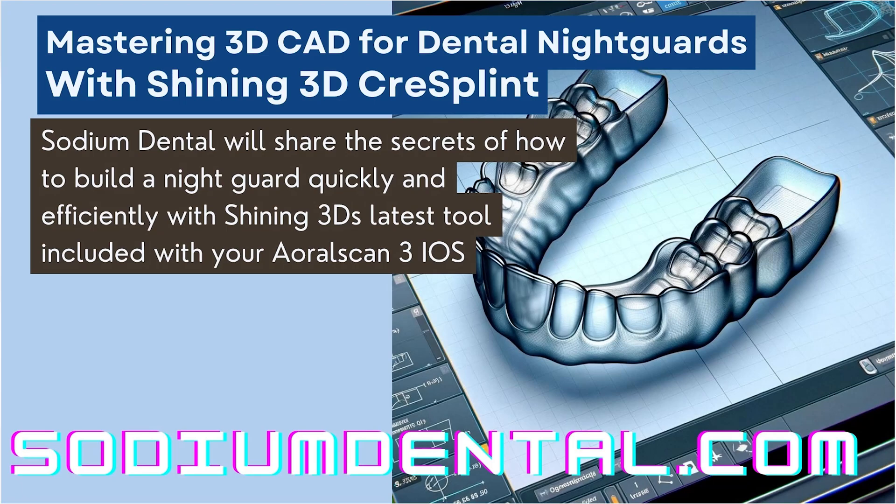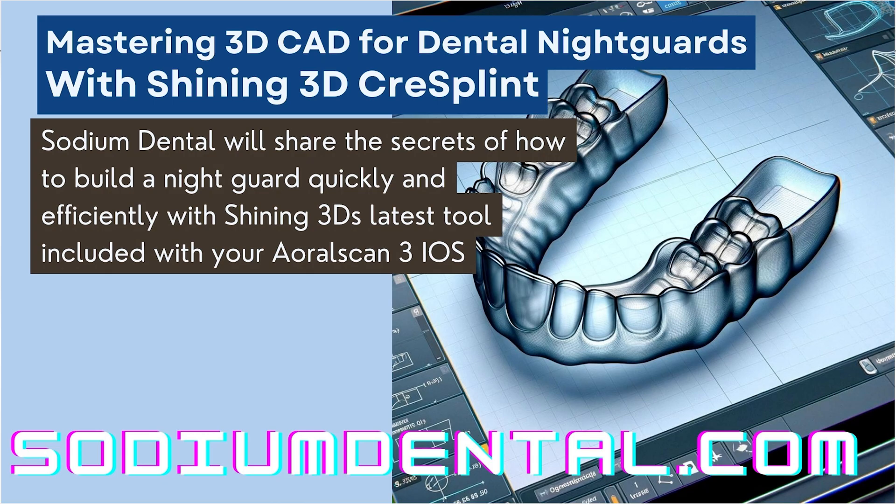Hi, I'm Sean Hall here. I'm going to be showing you how to use the Shining Aero Scan 3's new, very awesome built-in splint designer.